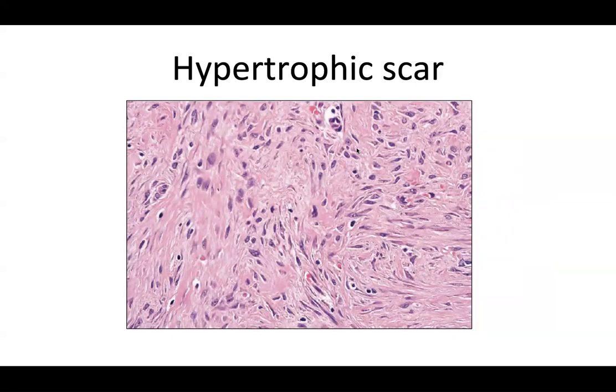On higher power, you see a fibroblastic proliferation. You do not see those thick bubblegum-like collagen bundles. So you can see hypertrophic scar-like material around keloid. And so if the clinician says rule out keloid and you don't see it, you might see it on deepers or in different sections of that bubblegum collagen. Otherwise, you're just going to see hypertrophic scar.